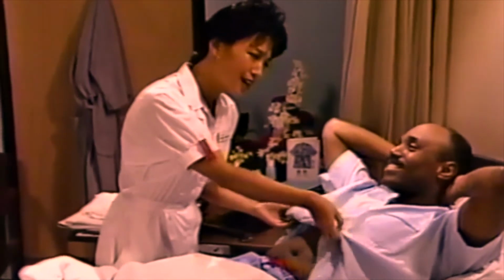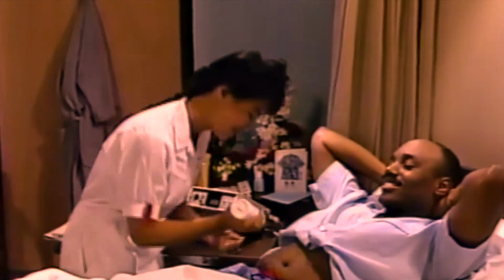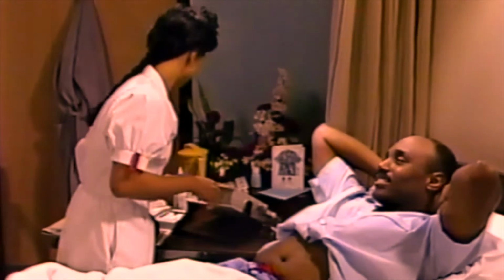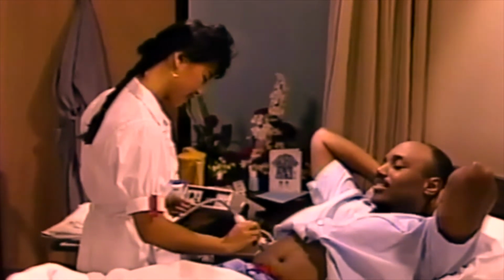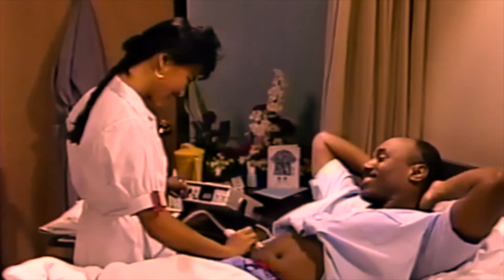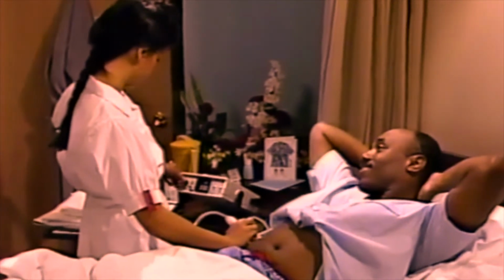Now, you've probably had an exam like this before, so you know it's not going to hurt at all, right? Well, I'll take your word for it. Here's some gel. Might be a little cold. Oh, it's cold. Okay, let's put a little bit there. Now, all we're going to do is just bounce some sound waves off your insides and take some pictures. It doesn't hurt, but it tickles. Gonna look for your kidney now. You can watch the screen with me.